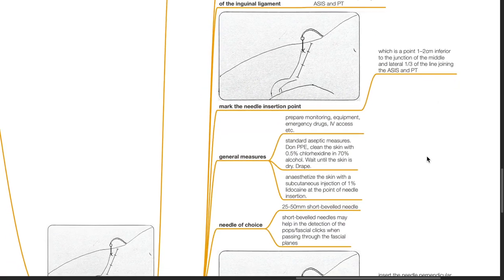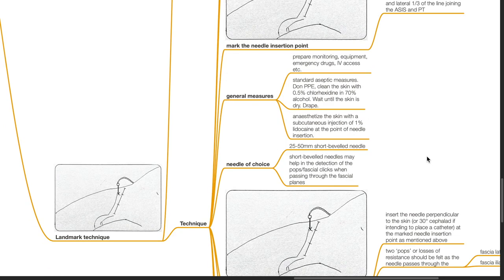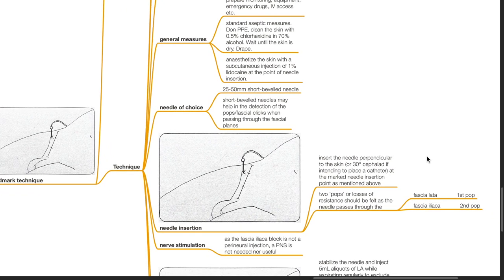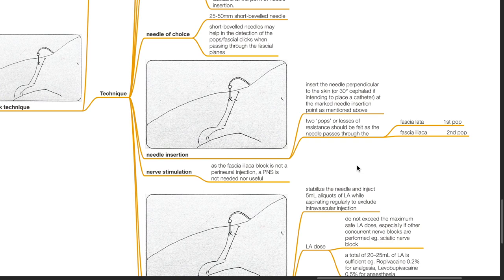General measures: prepare monitoring equipment, emergency drugs, IV access, standard aseptic measures, and anesthetize the skin with 1% lidocaine. Needle of choice is a 25 to 50 mm length short bevel needle. Short beveled needles may help in the detection of pops or fascial clicks when passing through fascial planes. Needle insertion: insert the needle perpendicular to the skin, or 30 degrees cephalad if intending to place a catheter, at the marked needle insertion point as mentioned above.